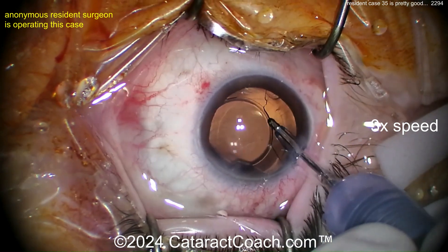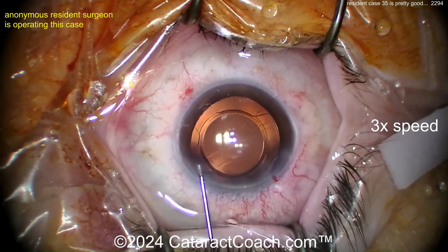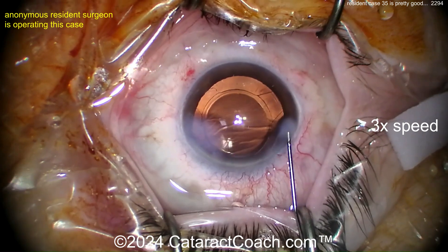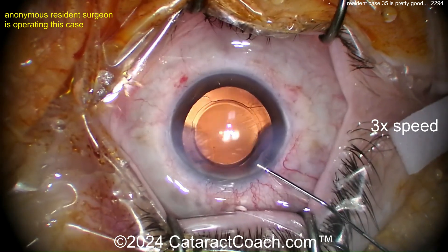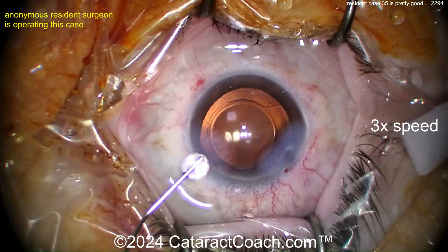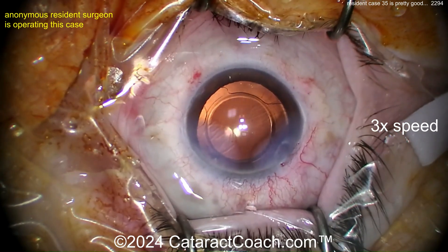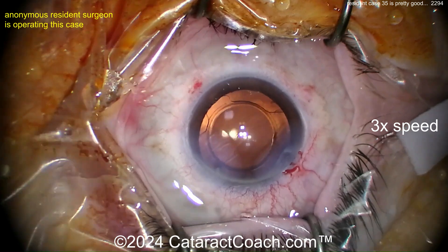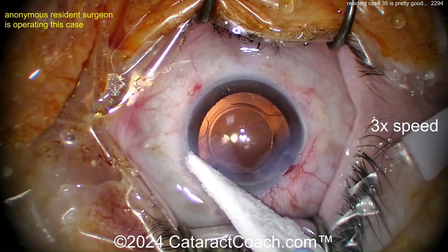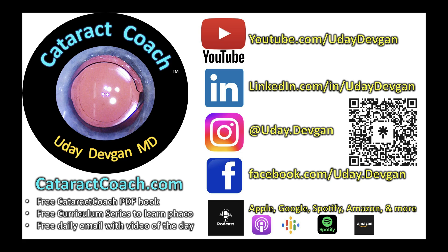Now going in — remove the viscoelastic and close the seal on these incisions, call it a day. For case 35 you undoubtedly have great hands — let's just put more effort into the little things. The draping, the incision could be a little better, and what's with the hydration? Mega-hydrate? No. I have videos on how to do proper hydration — please do not hydrate right in the visual axis. Please do a better job with hydration. Check out that podcast every single Sunday everywhere you find podcasts — you will learn so much.